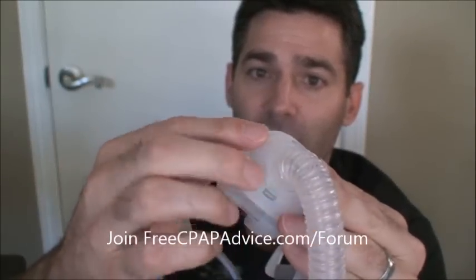You have an expected leak. I don't know if you can see on this mask, around here on all masks they have some kind of a diffuser, so when you're exhaling, that air gets back out into the atmosphere, and then more air is coming in through the CPAP. This is so you're not rebreathing the CO2, and you don't wake up with a headache. That's a good thing. That's called expected leak. Then you have unexpected leak. Unexpected leak is things like mouth leaking, things like mask leaking, things like when you take your mask off and throw it across the room. Any type of leak that you don't want is an unexpected leak.